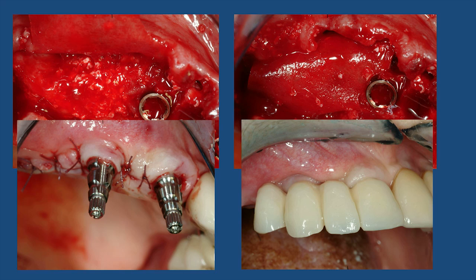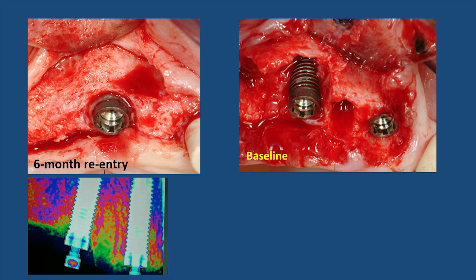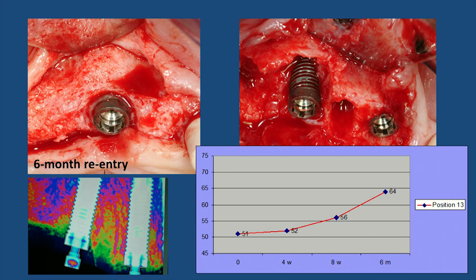And after 6 months, this is the re-entry surgery. If you compare it with the baseline, you can see the complete coverage of the exposed part of the implant. It is interesting to notice what happened from the ISQ point of view. There is a maintenance of stability over the first 4 weeks, and then the stability tended to increase continuously up to 6 months.